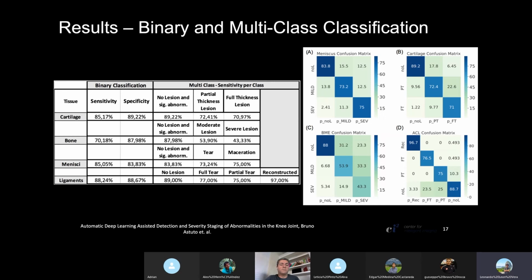I run the whole pipeline. First, to answer your question, these are results generated on a holdout set, so this is a separate data set. I took all the images in the test set. I don't remember exactly the size of the test set now. I ran the whole pipeline over it, and these are the numbers that the pipeline gives me.